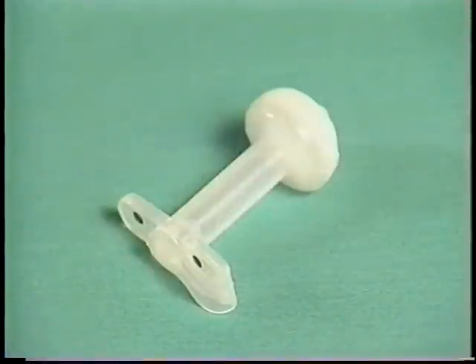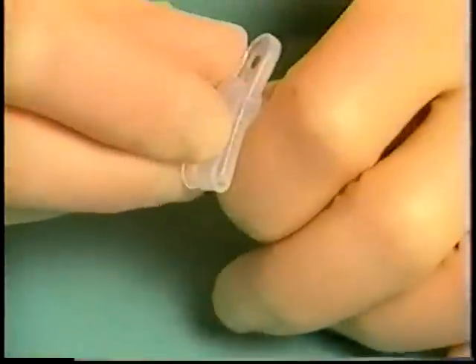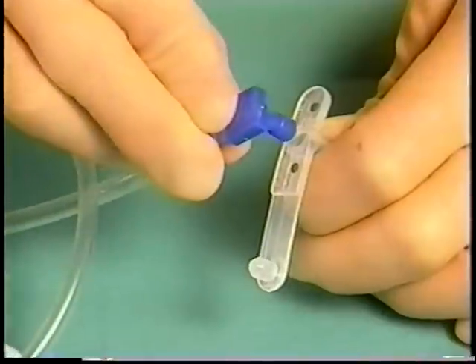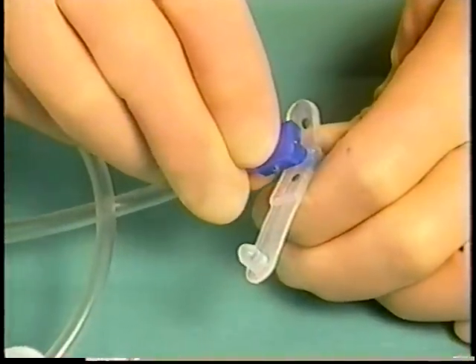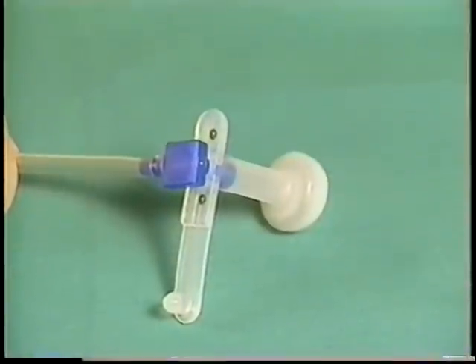The low-profile design is much less obtrusive to the patient, making it a popular option for alert patients, particularly those who lead active lives. However, these devices require attachment of specific adapters to enable administration of feedings, and this may be difficult for some patients.